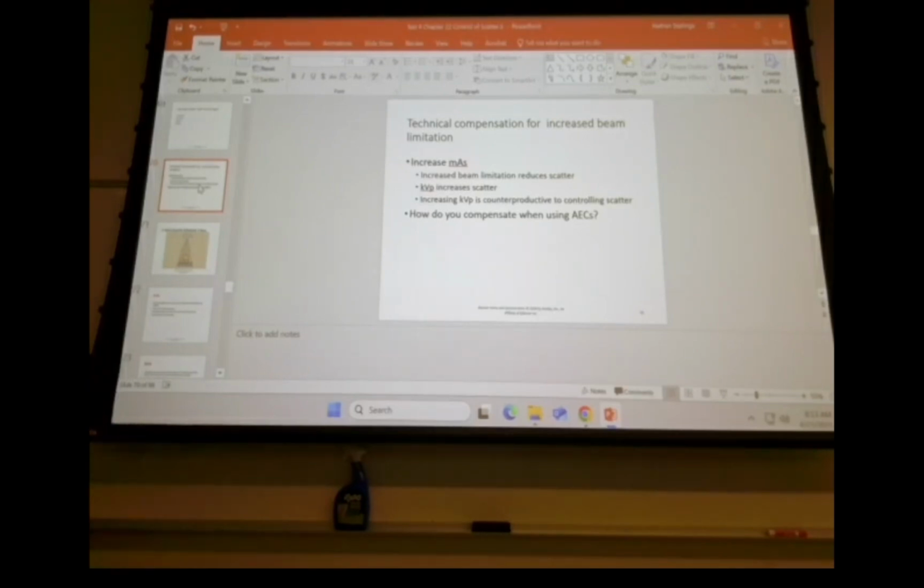So Ariely asked a great question, and her question was, does filtration add to scatter? And the answer is yes. Not in as much as you're probably going to hear any kind of question on, not on my test and certainly not on the registry about it, but anything that pushes the beam spectrum towards a high energy side is going to give you a higher percentage of scatter penetrating through the patient.